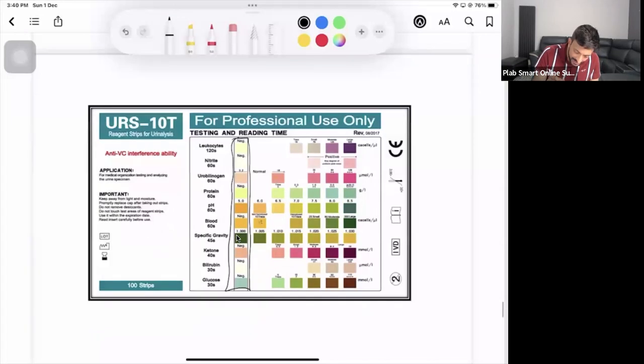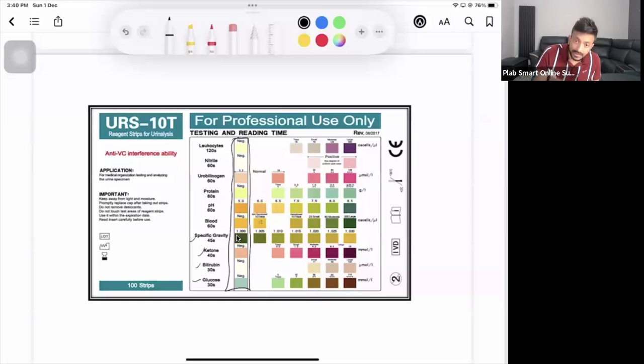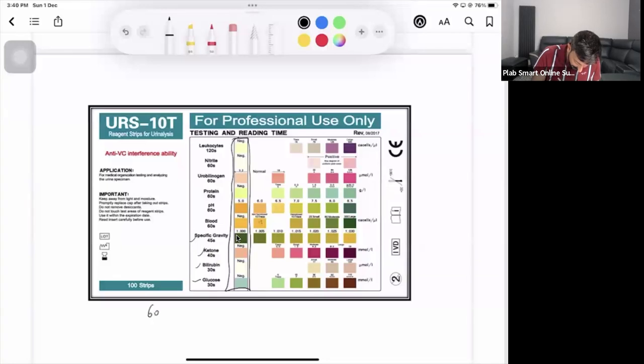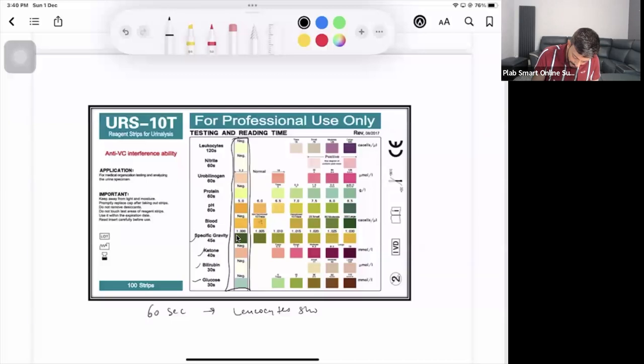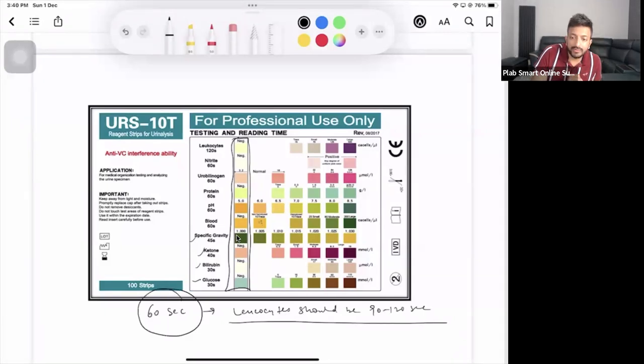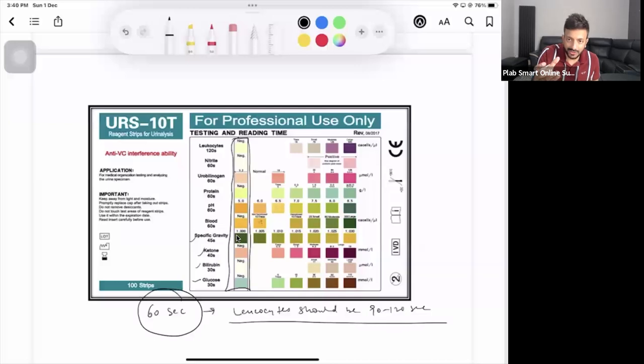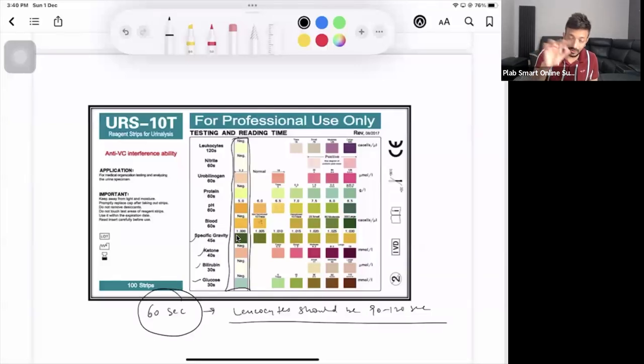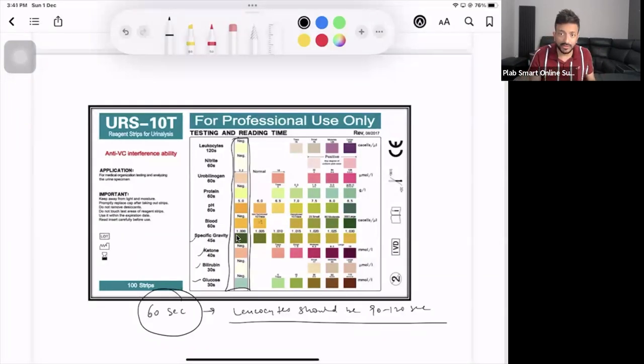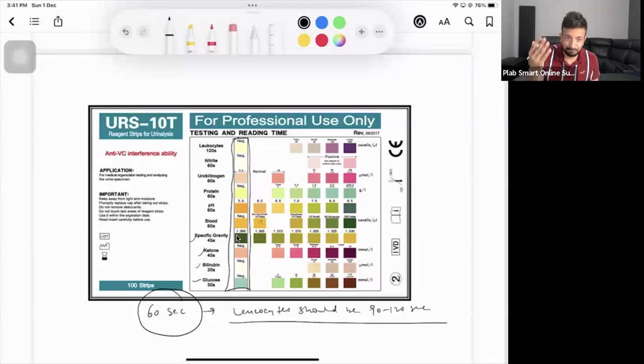When we start reading, we start from the bottom: glucose, bilirubin, ketone, and so on. Usually the bottle says you should start reading after 60 seconds, but leukocytes should be 90 to 120 seconds. If they haven't given you a watch or clock in the room, you just have to guess the time.